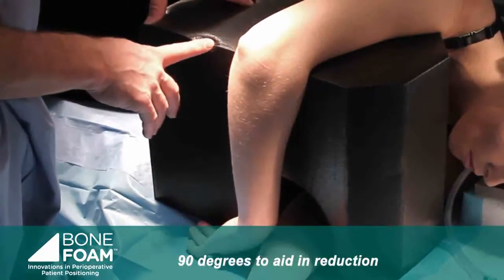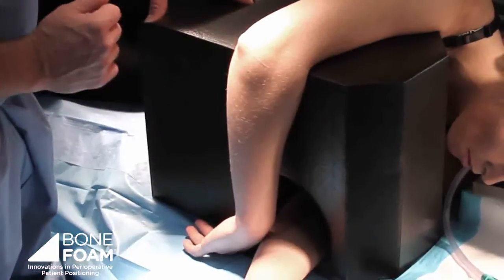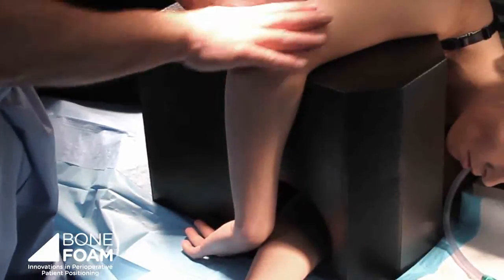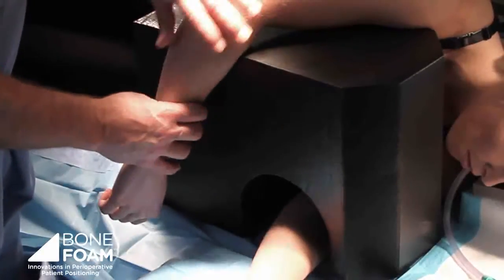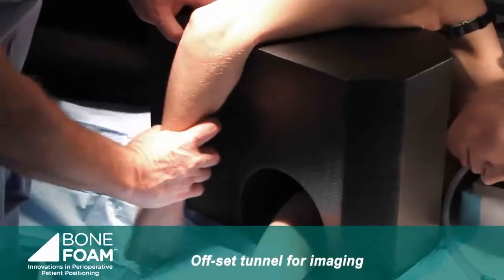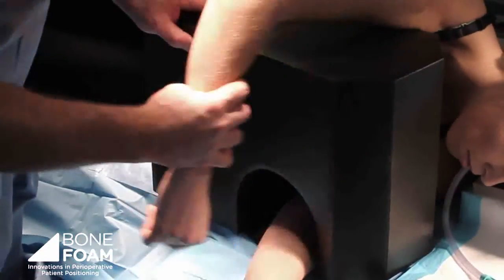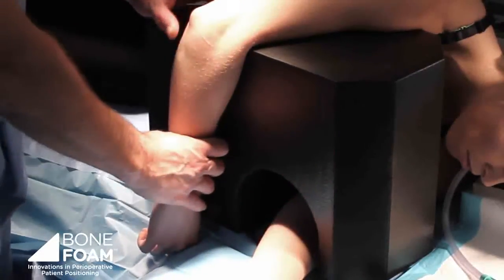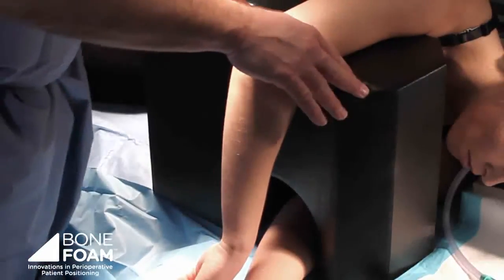And some people prefer the elbow to just be at 90 degrees, like so, while doing this work. You can also see another feature is that because of the offset tunnel, the surgeon can manipulate the elbow to one side or the other while imaging, so that you get the opposite extremity out of the way. An alternative to this 90-degree position would be our upper extremity positioner, which allows for some extension of the elbow, which I will demonstrate next.